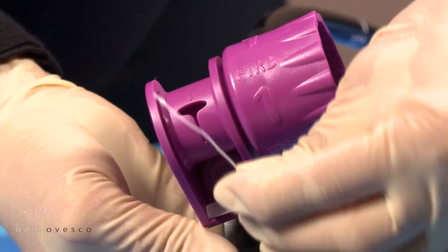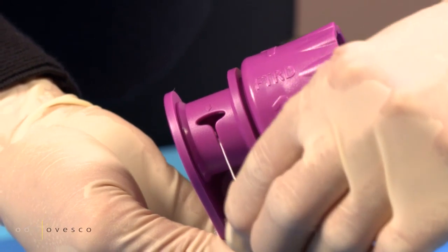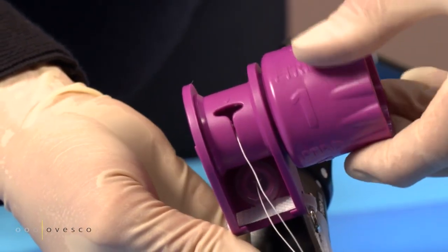Fix the thread at the hand wheel and wind it up, same as with the OTSC system.